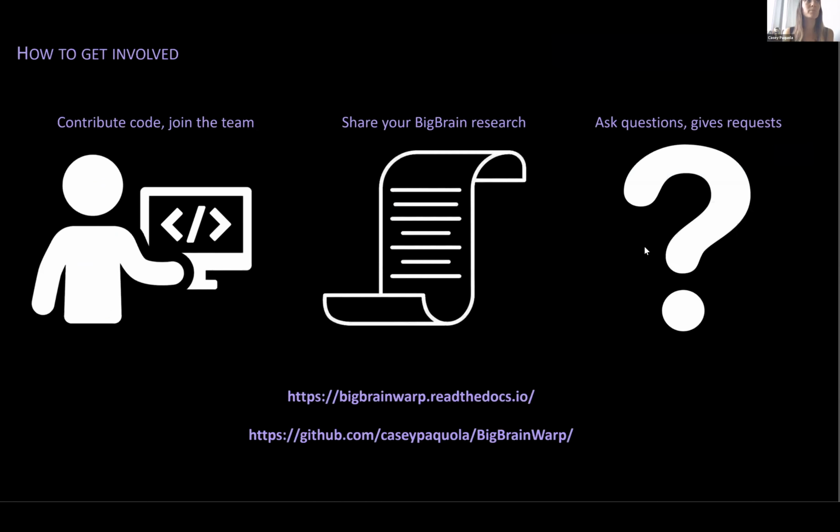So BigBrain Warp is really designed in a modular way to support the integration of more techniques as they become available too. And certain transformations I mentioned are likely to work better in certain situations. So we'd like this ecosystem to keep growing, and that really depends on your input. So I'd like to invite anyone who's interested to join the team. If you see something you think you can help with, get in touch. We're more than happy to add more collaborators.